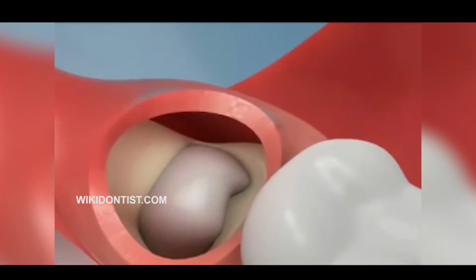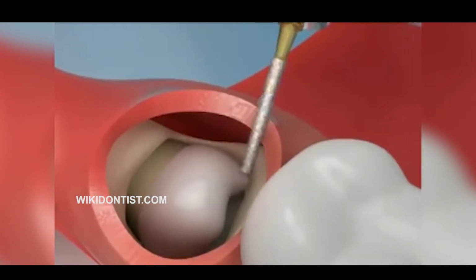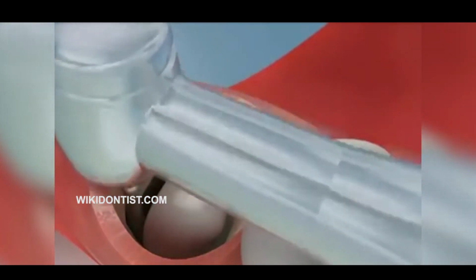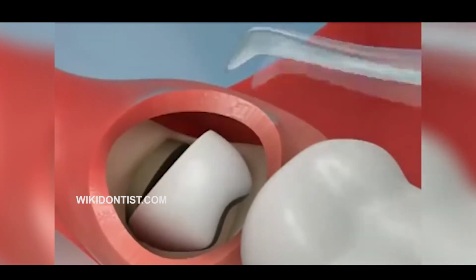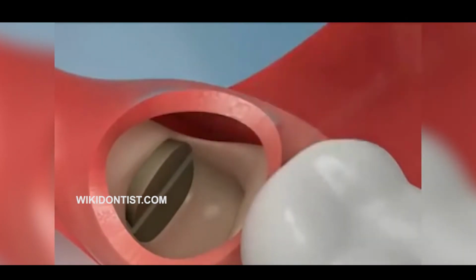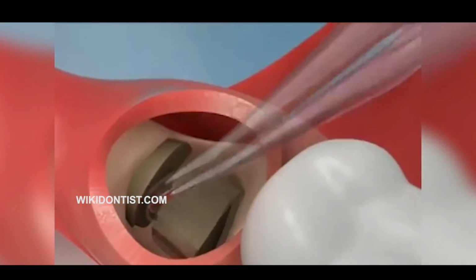If the tooth is not at all exposed, then we have to make an incision and open it up. Once the tooth is seen, we cut the crown portion of the tooth, which is what you see outside. There is a root which remains there, and the crown is taken out first. Then we cut the root into small pieces and slowly nudge the root into the cavity.